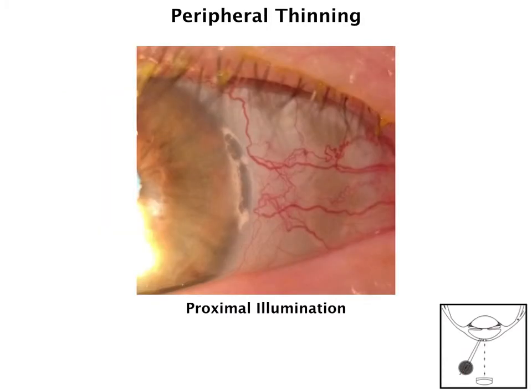One of the more difficult pictures to get is peripheral thinning. The best way to do this is with proximal illumination — I'm shining the slit beam a little bit off to the side next to the area of interest, and it really helps to highlight that peripheral thinning. You'd have the slit lamp straight on and the light just a little bit off, and you could even maybe rotate the whole tower just a little bit to get a better angle — it really depends on the patient to see what works best.